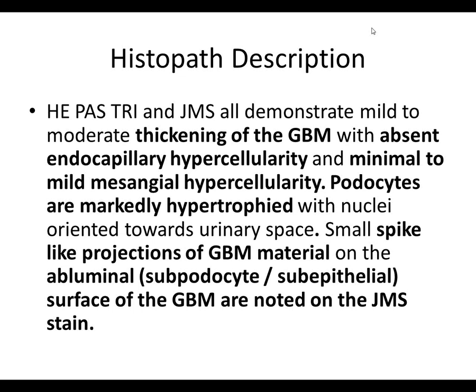In this particular case, you really couldn't appreciate the immune complexes on the trichrome stain, although in some cases they're quite prominent and we can see them on the trichrome stain. It just wasn't present in this particular case.